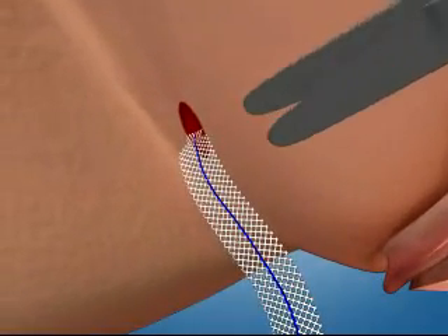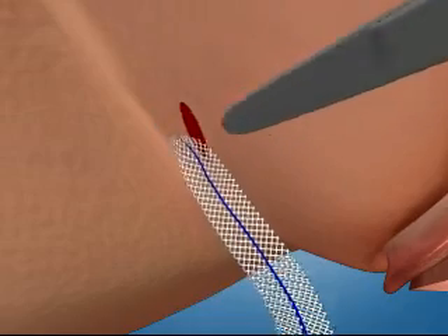Trim the mesh at subcutaneous level and close the skin incisions. Finally, close the vaginal incision.